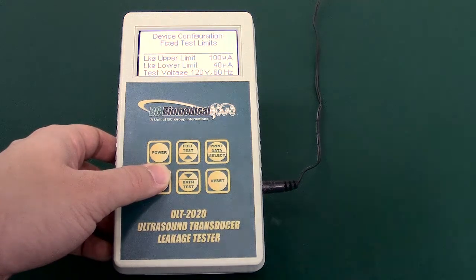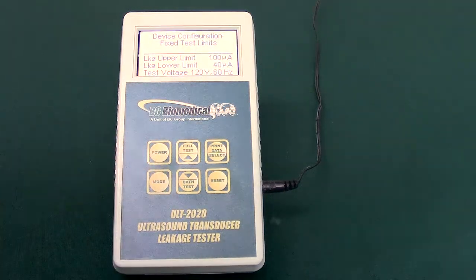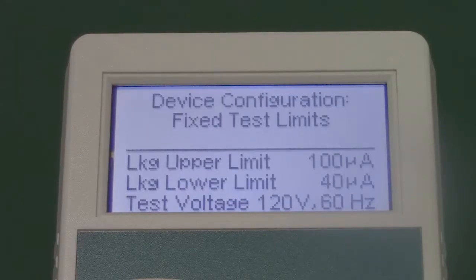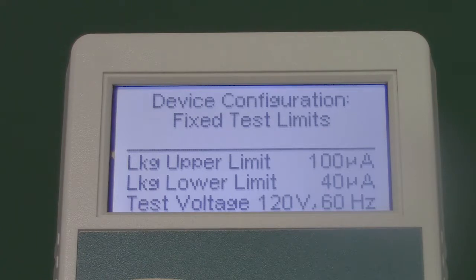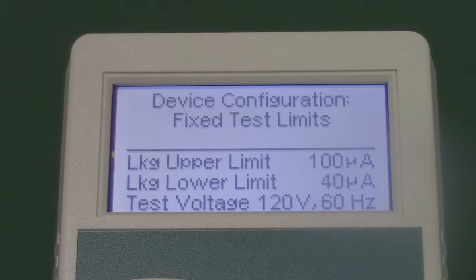The first setting is Fixed Limits. These are limits that are pre-programmed into the ULT by BC Group. The limits are fixed at 100 microamps upper limit, 40 microamps lower limit, 120 test voltage, and 60 Hz.